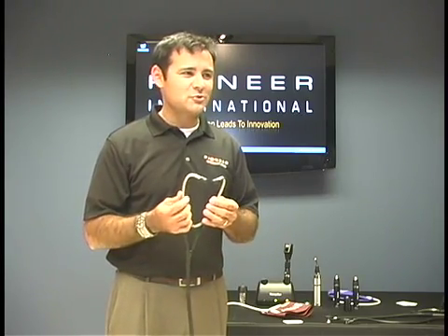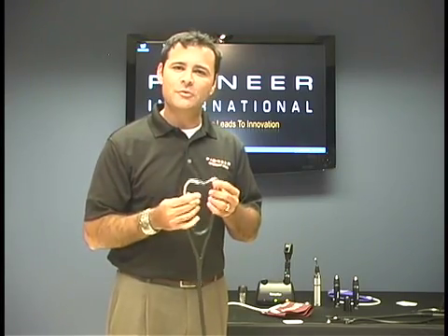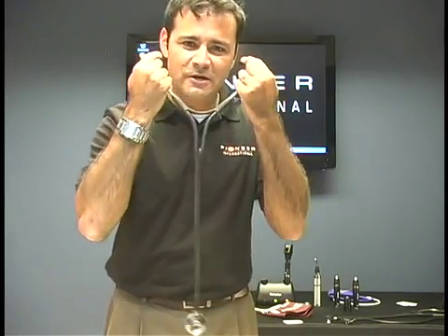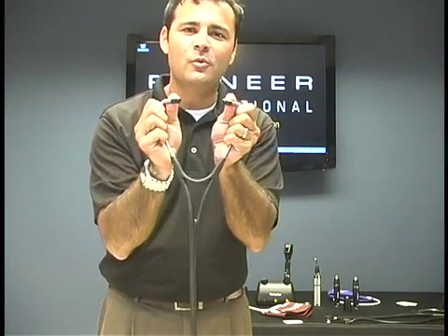The binaurals — you want to make sure they are pointed away from you so that you get good quality sound. One of the most common problems is people will take them, rotate them the wrong way, put them in the ear, and basically you're blocking the hearing. So again, make sure the binaurals go away from you.